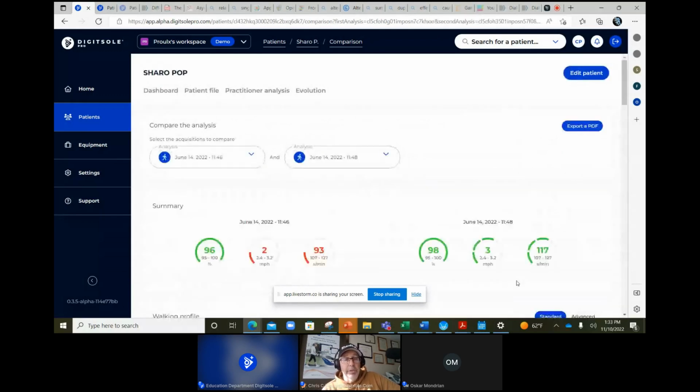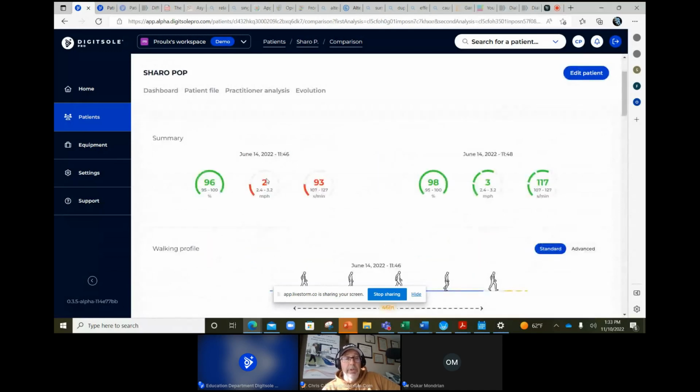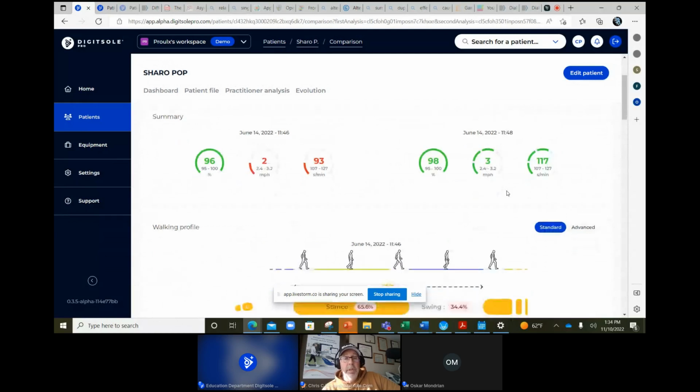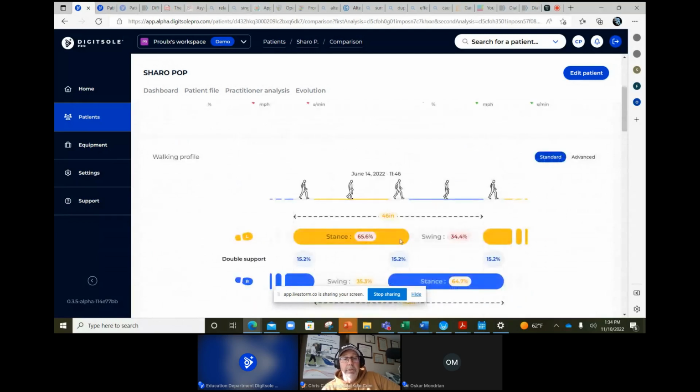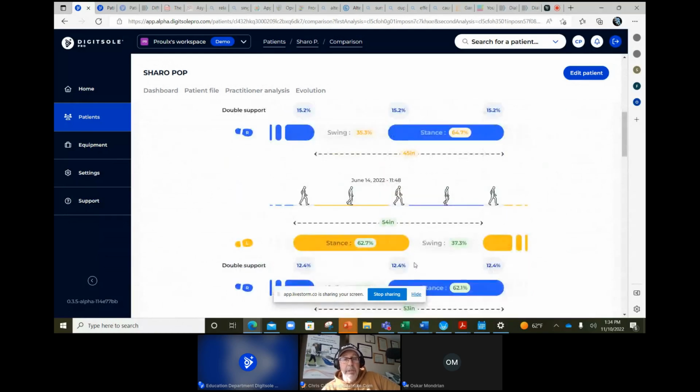So there was no treatment that occurred with this patient. Okay, so this is the one I just showed you over here on the left, and then the one on the right. So this is actually having her walking at 3 miles an hour. Again, this is on a treadmill because I wanted to control the amount of stress that I was introducing into this patient. As you can imagine, this is the slower speed, this is the faster speed, right?